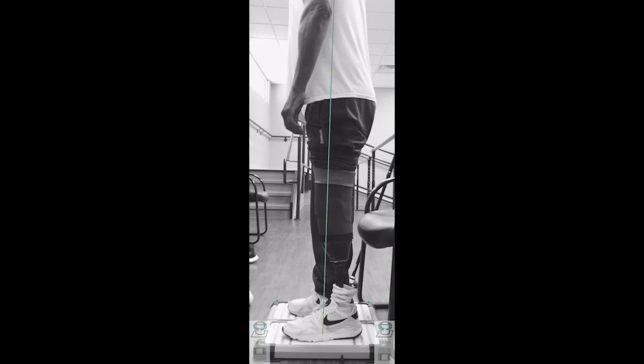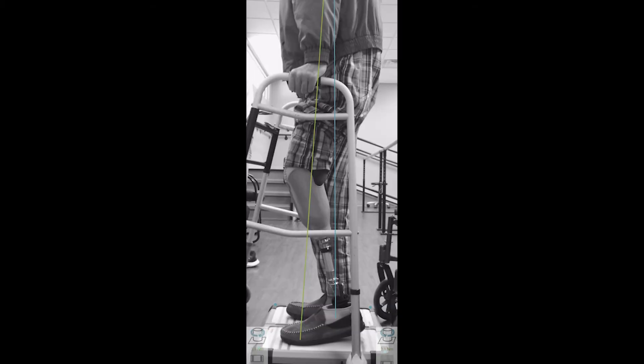There is also a third example in which the lines are parallel but not overlapping, which we will discuss shortly. In this first image, you can see that the lines originate from different points within the sound and prosthetic foot and then come closer together as we approach the head. This shows us that the patient's weight is all on the prosthetic toe and it is not being equally loaded throughout the whole length of the foot — this is an extreme case for demonstration purposes, and you can see that the heel is not even touching the ground. A patient left in this alignment would have difficulty clearing their toe as they swing the prosthetic leg forward, or even difficulty rolling over from heel to toe in general. We should first bring the foot to a position in which it is flat on the floor, and then re-evaluate the tilt of the socket.